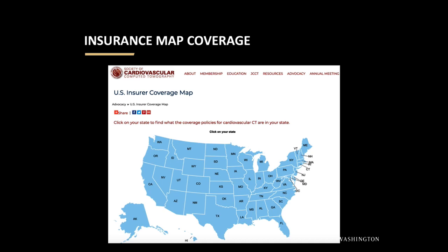So I think one way to potentially combine them, I don't know if I have the answer on how best to combine the two or use them. I think it just gets back to the simple question of, what are you clinically getting the test for? If it's microvascular disease, CTA probably isn't the best test, and you would do a nuclear PET stress test. If you want to know if the patient has coronary disease or not, and you can rule it out, I think CTA answers that question. If you want to know exercise capacity, functional capacity, CTA doesn't answer the question. So I think it just gets back to what the indication is.